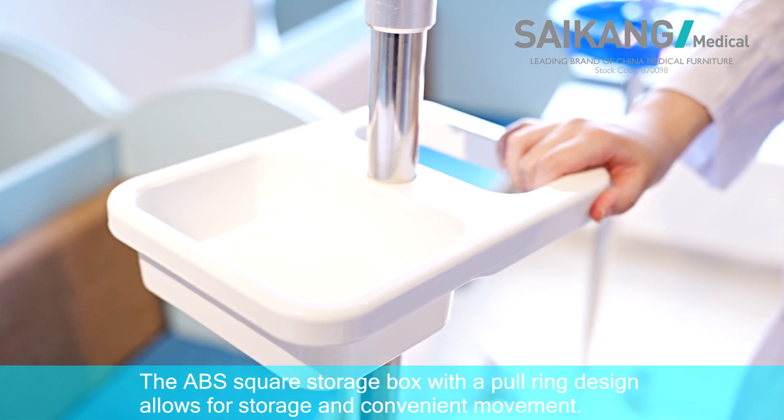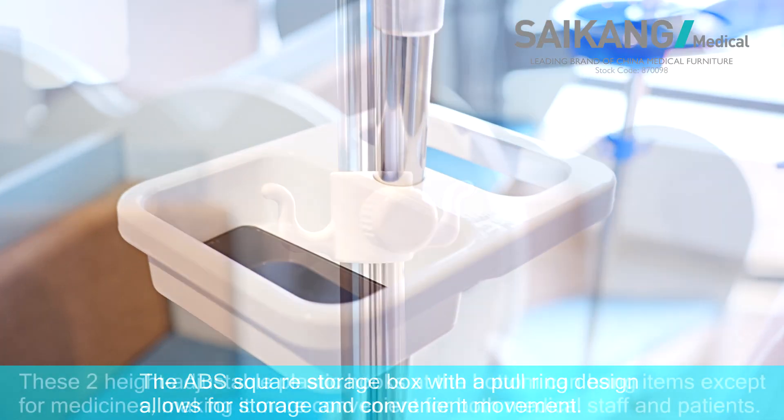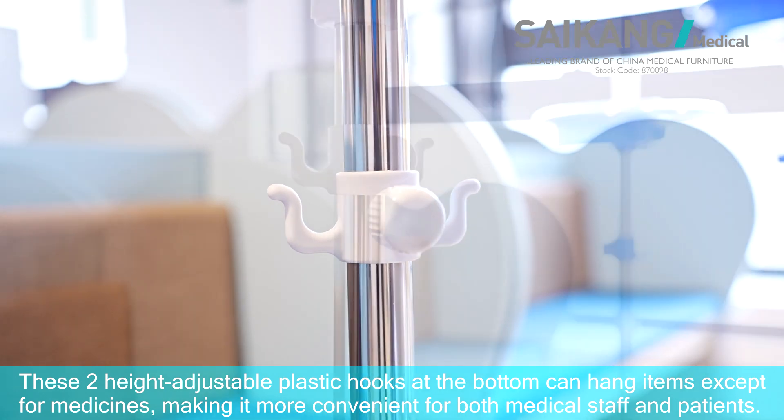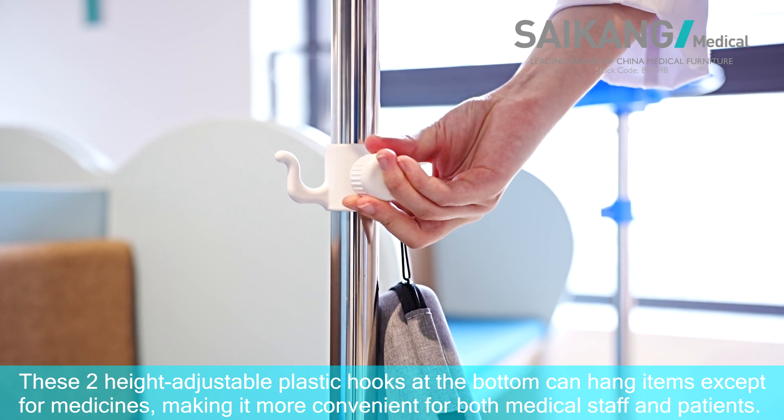The ABS square storage box with a pull ring design allows for storage and convenient movement. These two height-adjustable plastic hooks at the bottom can hang items except for medicines, making it more convenient for both medical staff and patients.